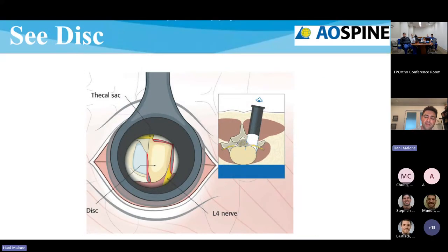At this point, if you need a contralateral decompression, then I'll probably just windshield wipe my tube over so I can see that contralateral trajectory. You can also, if you're just using a single MIS dissection, do a pretty good job if you spend some time releasing the contralateral facet. You just keep going lateral into the facet joint, and you can really loosen it up to allow for better compression and lordosis.